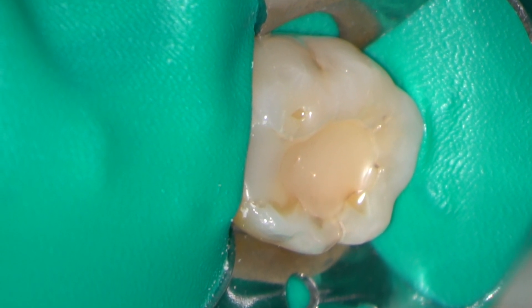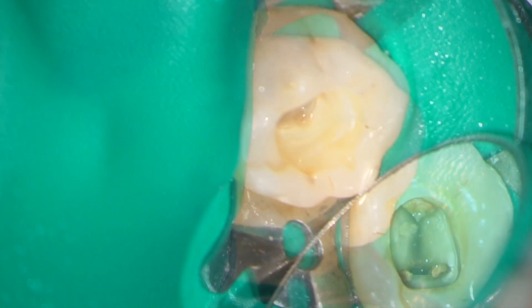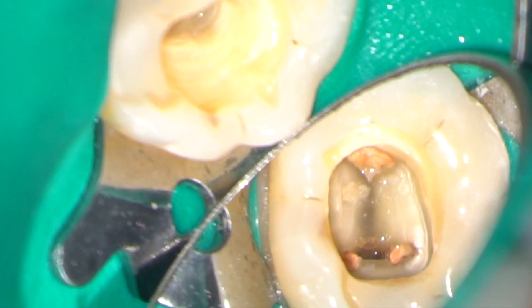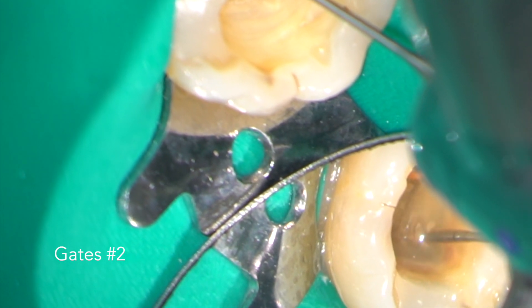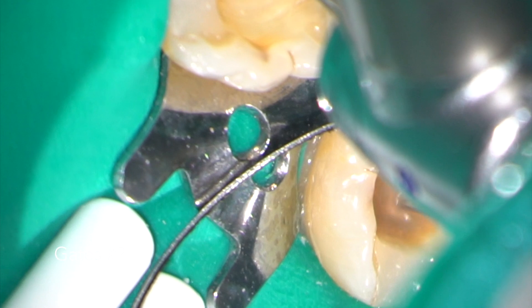The existing composite restoration was simply removed with a long tapered diamond. Under high magnification you can see voids alongside the GP cones in the mesial root.